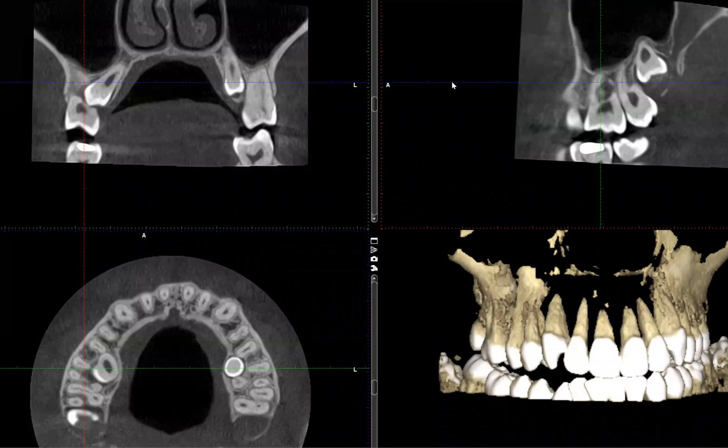So in today's case, you're seeing a 15-year-old patient with two supernumeraries — not just one, but two supernumeraries. So let's find out where they are and what they are doing to the surrounding structures.